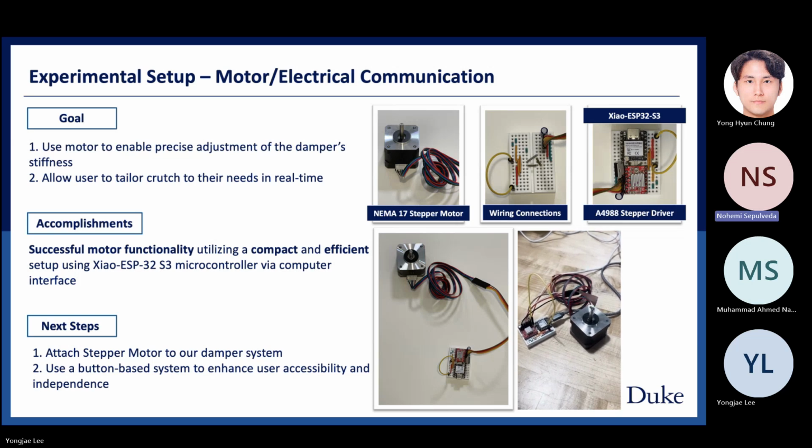As we can see in the images right here, we ended up using the Xiao ESP32S3 as well as the A4988 stepper driver using a computer interface. For future work, if we had a little bit more time, we would have liked to implement our motor into our crutch using a simpler control mechanism, like a button operated one instead of using the computer interface, since we really want to make sure that our crutch project is as simple and as versatile as possible.